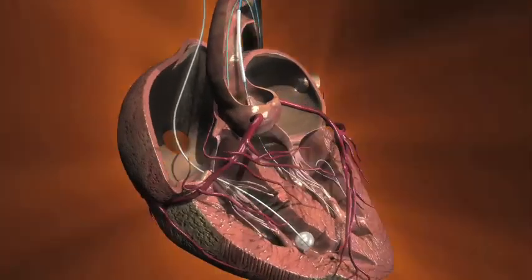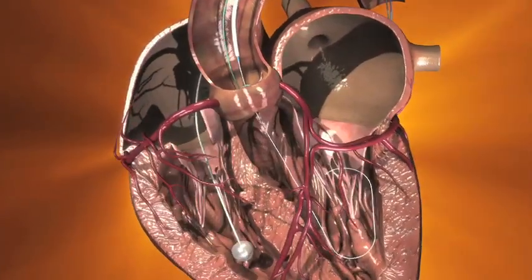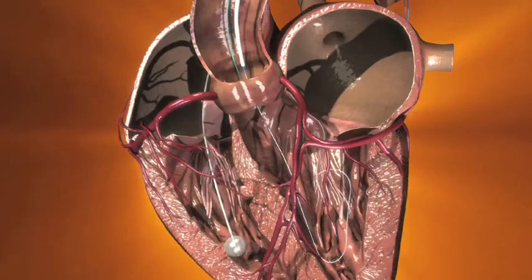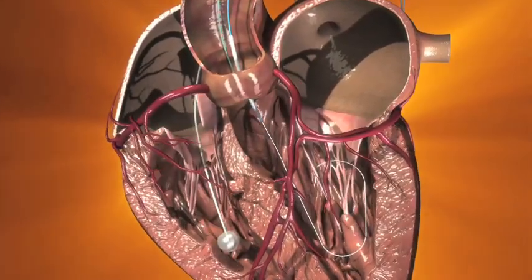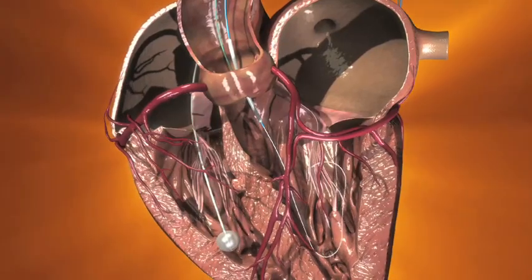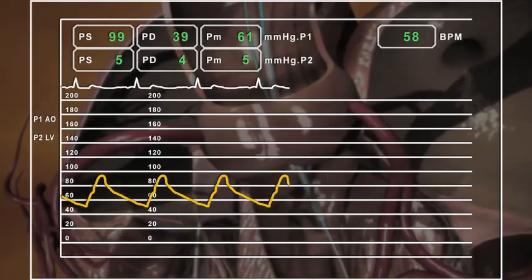Reposition the camera to the ideal viewing plane as previously described and advance and position the balloon across the native valve while maintaining strict fluoroscopic surveillance of the distal tip of the guide wire in the left ventricle. Give the command to start rapid pacing.